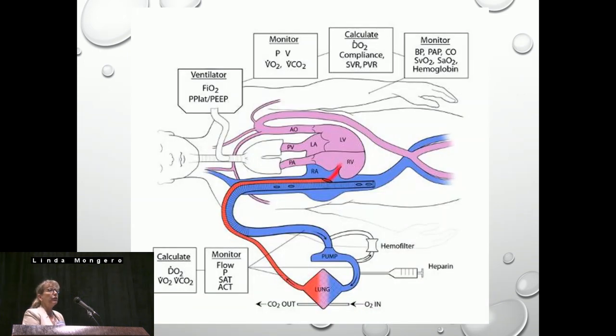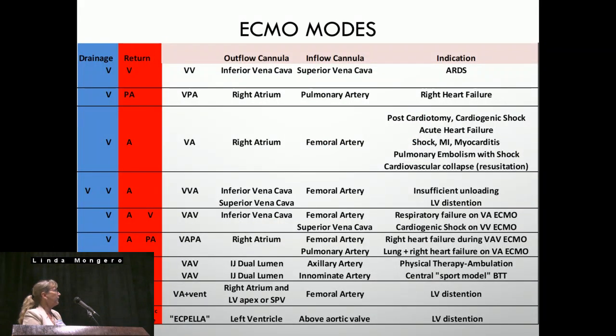To begin, ECMO is extremely complicated, and it is getting more complicated, especially with all the new kinds of cannulation techniques. We always tried to keep it simple when we did ECMO and have the circuit be as streamlined as possible, with fewer connections and no pigtails, and we'd hope that it would make it safer. It's getting more and more complicated, with more and more cannulations for each circuit, but nonetheless, that's where it's going. These are the different modes.